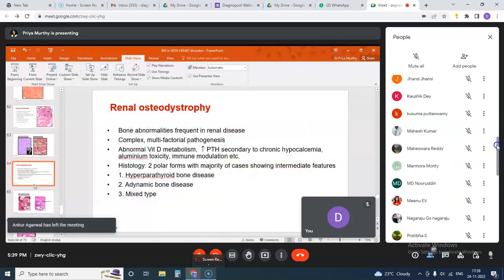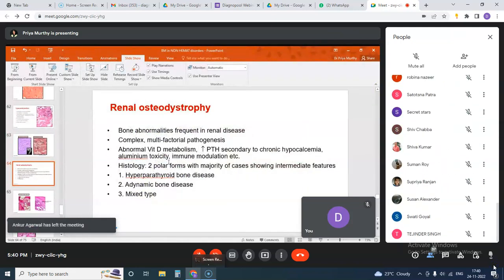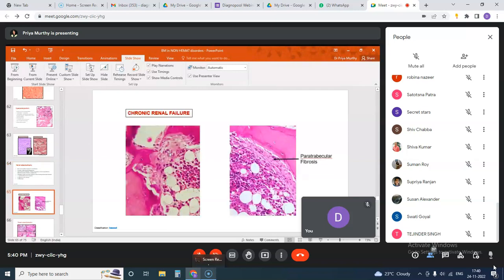Renal osteodystrophy as well. There are a number of bony abnormalities present, similar to what we saw in hyperparathyroidism. And here we see that the bony surface is irregular, it is not smooth. There is associated paratrabecular fibrosis. Look for the specific band. And then when you ask the patient for history, whether he has any features of raised creatinine, urea, you will come to know that there is probably some renal changes happening within the marrow.